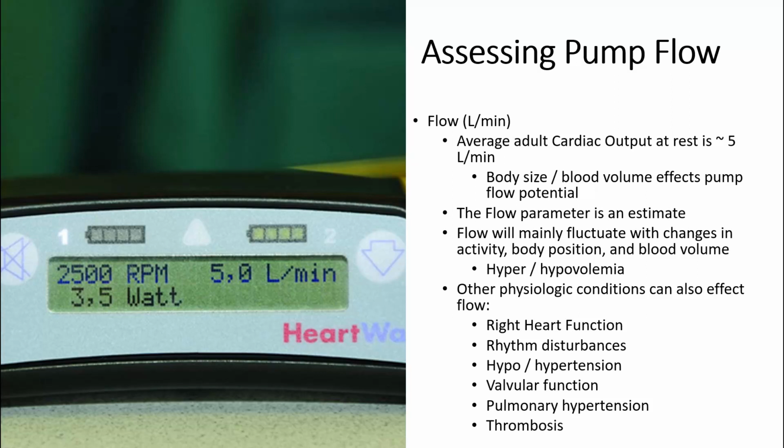So, foreshadowing, fluids are one of your major interventions when you have low flow rates and hypoperfusion.